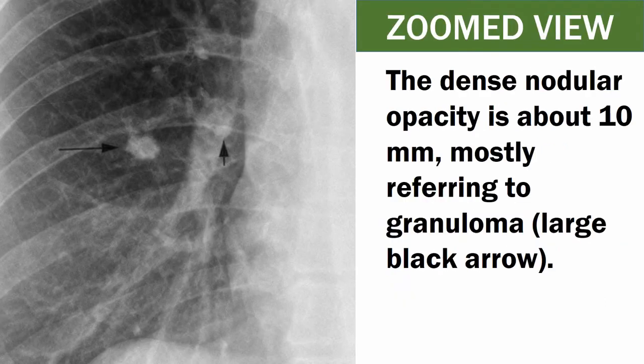This is the zoomed view of the previous x-ray. The dense nodular opacity is about 10 millimeters, mostly referring to granuloma, which is shown with the large black arrow.